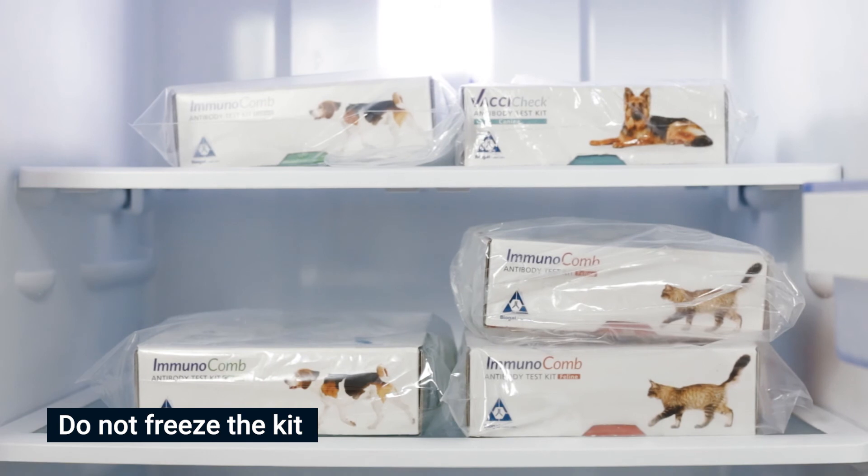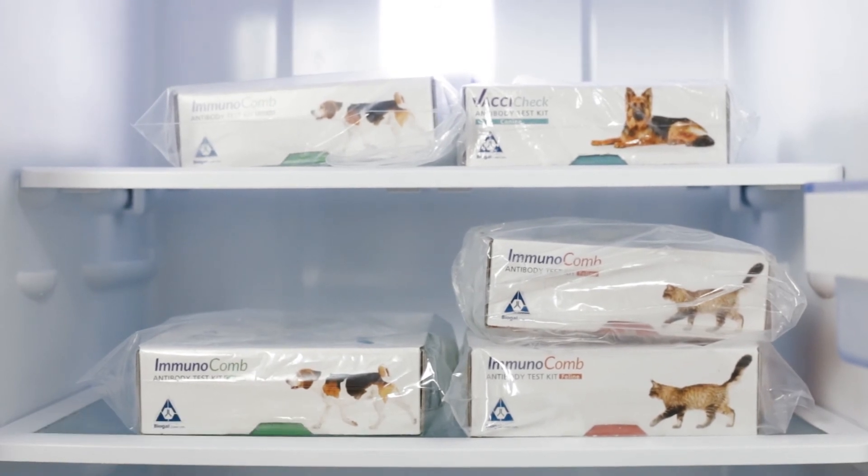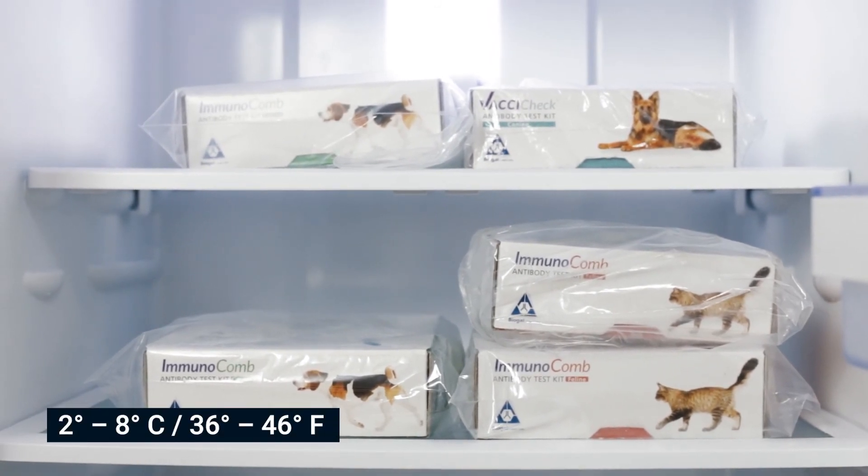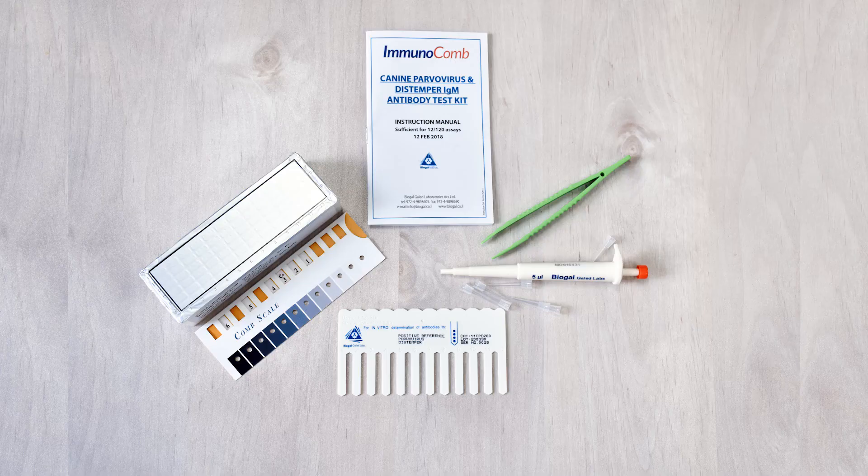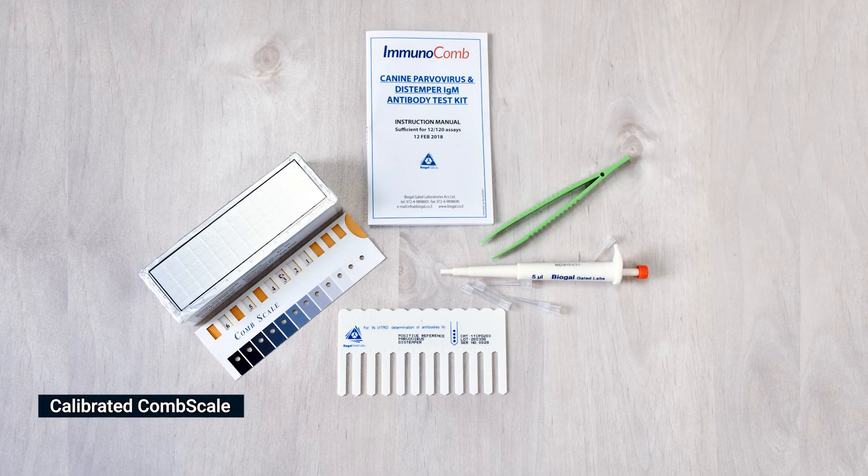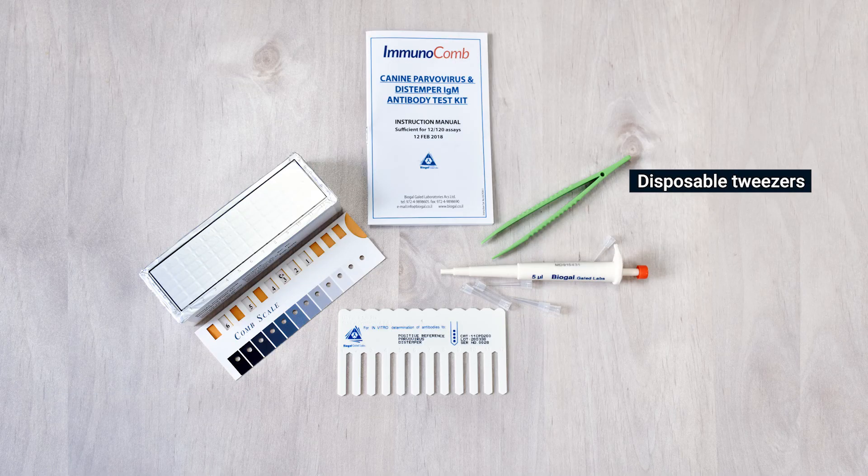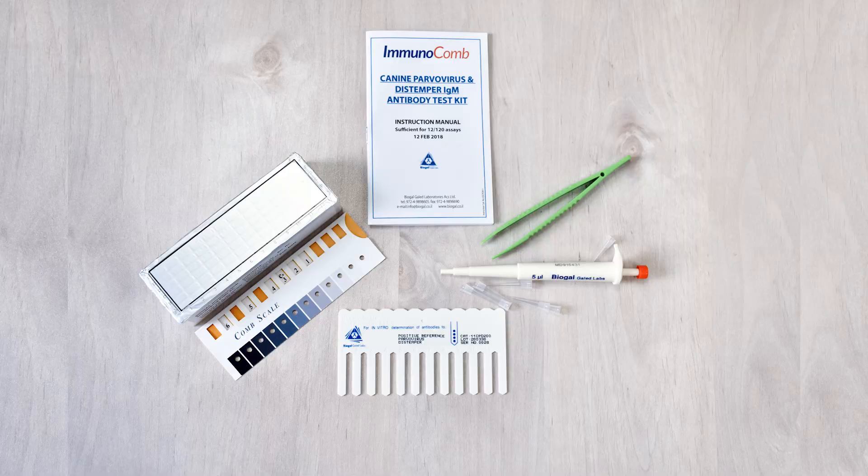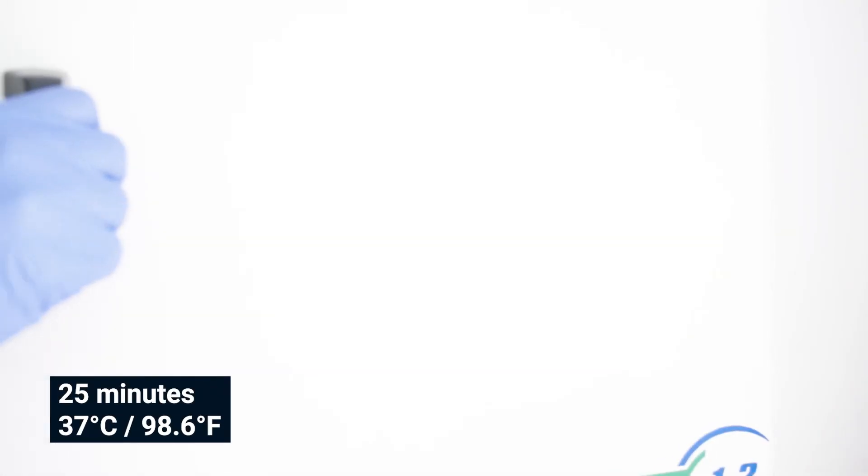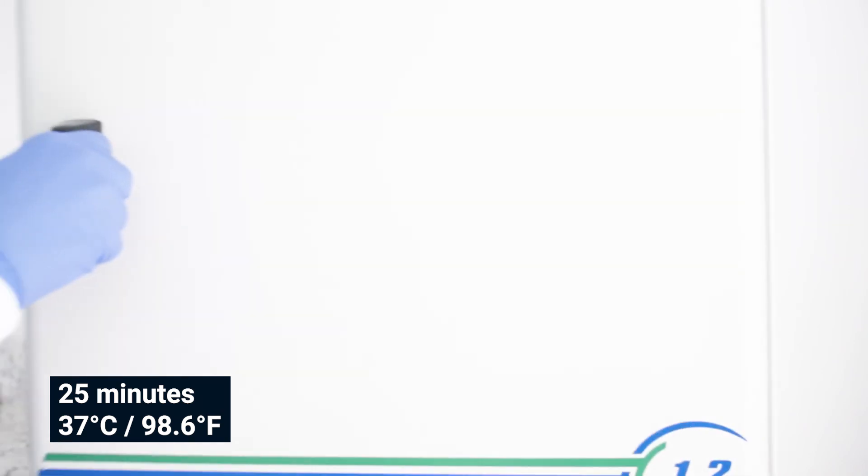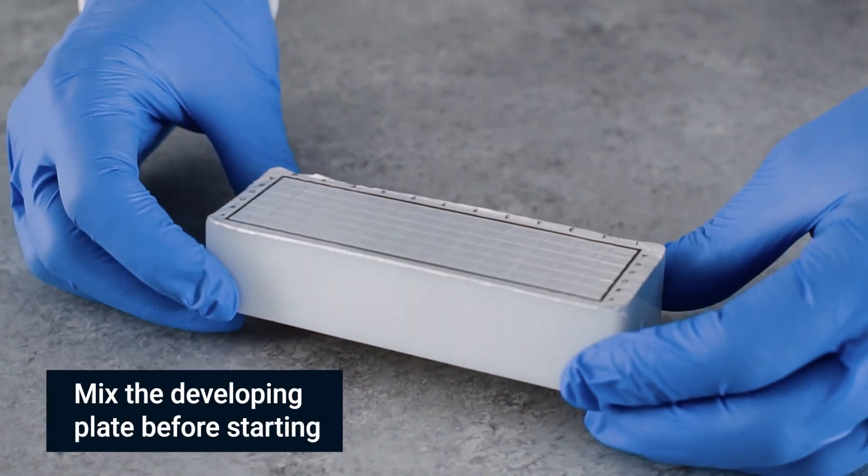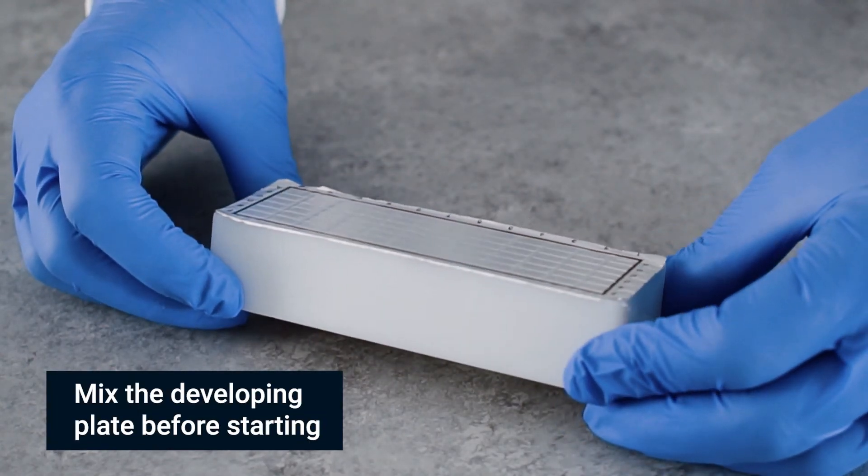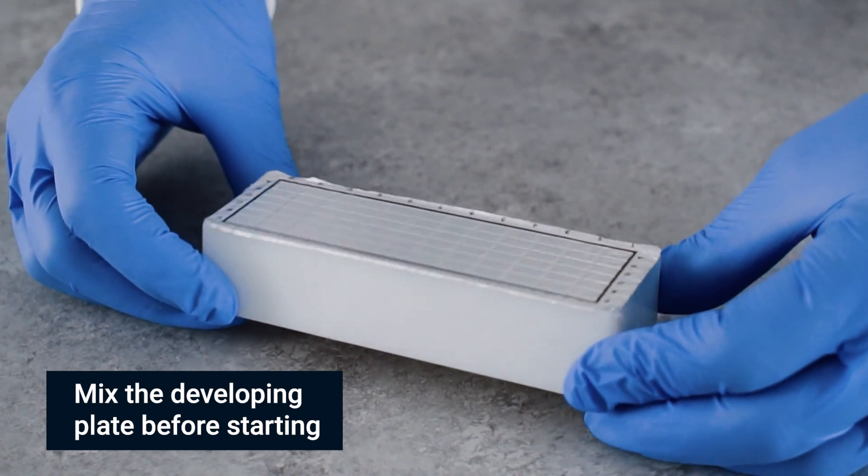Store the kit under refrigeration between 2-8°C (36-46°F). Before testing, bring the developing plate to room temperature by removing all kit components and placing them on a workspace for 60-120 minutes, or incubate only the plate at 37°C (98.6°F) for 25 minutes. Mix reagents by gently shaking the developing plate several times.